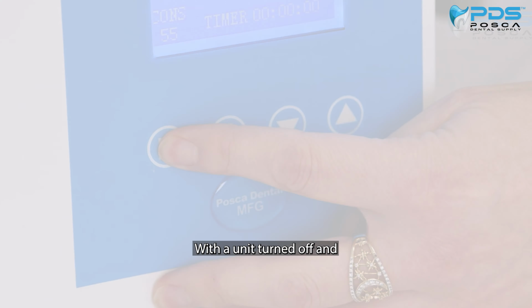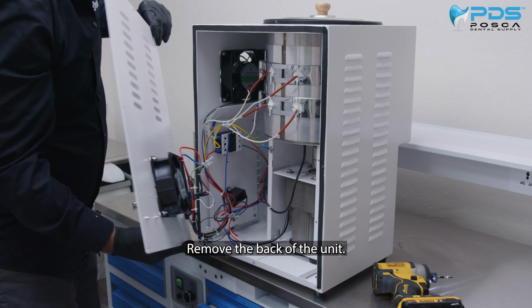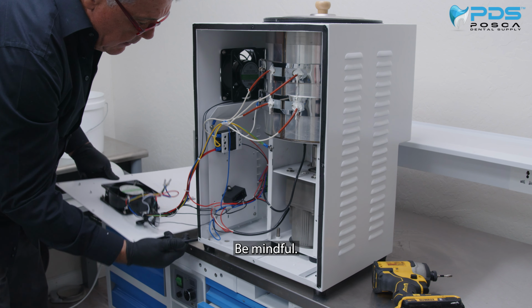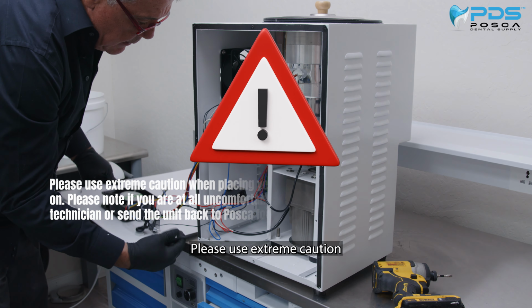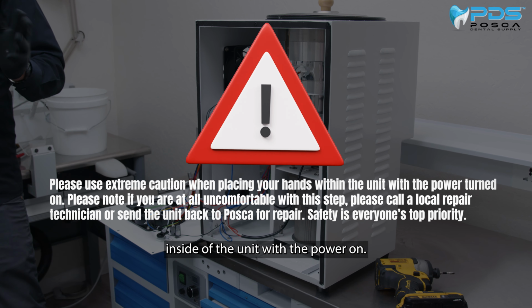With the unit turned off and unplugged from its power source, remove the back of the unit. Place the back of the unit to the side carefully. Note that it is still attached to the unit with wires. Be mindful. For this section, you will be turning the unit back on with the back panel removed. Please use extreme caution when placing your hands inside of the unit with the power on.